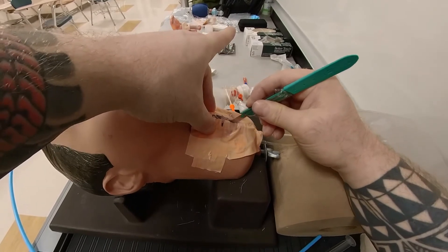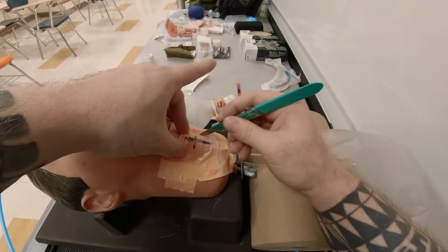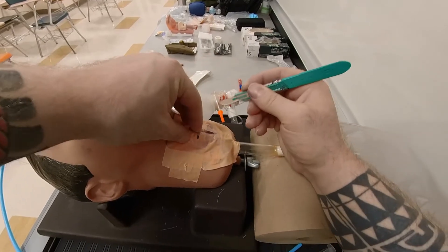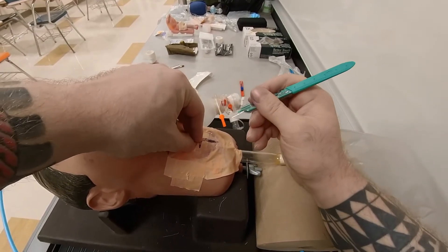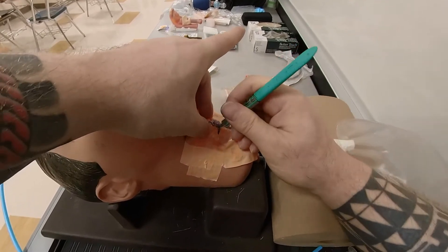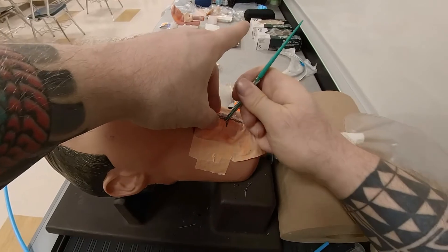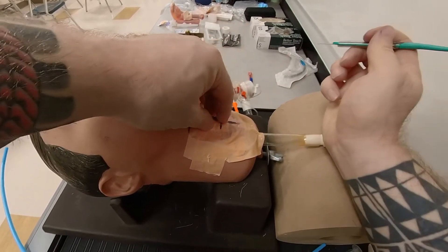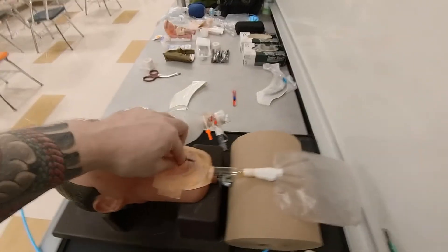You may not always penetrate that area on the first pass because of soft tissues — you may need to make another incision, and that's fine. Then your next cut is a plunge cut straight down. Rotate the blade to one side, then to the other side. Blade goes away, finger goes in. Close and safe the scalpel.